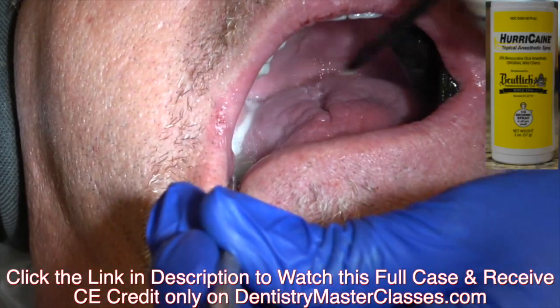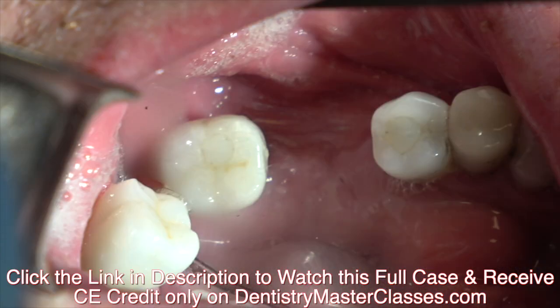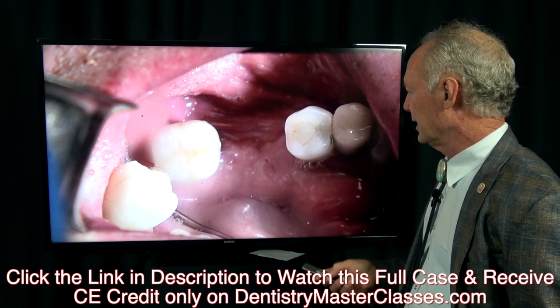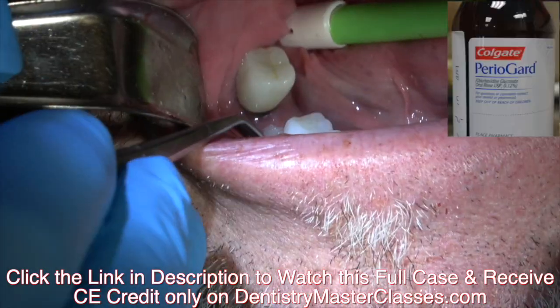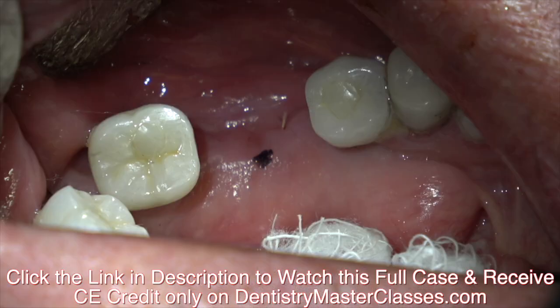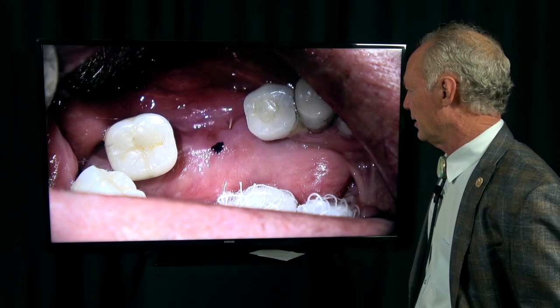First, painless and profound local anesthesia — so important. This is a tooth that's been extracted and now the socket has healed for at least six months. When I extracted the tooth, I grafted it with platelet-rich fibrin and freeze-dried bone. I'm wiping the edentulous area with Periogard on a cotton ball.